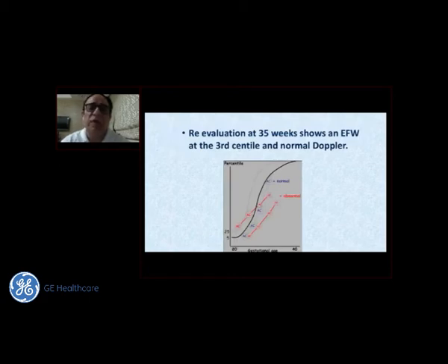But in all probability, if she's a small mother with normal Dopplers at 34 weeks, there's a good chance that she may be normal after 2 weeks. But you never know. Like I told you, sometimes surprises come up. And therefore, when we're talking FGR, the cutoff of anything is arbitrary. Like between late and early IUGR or between normal and abnormal, everything is arbitrary till you show it's normal. So we have to wait and watch.